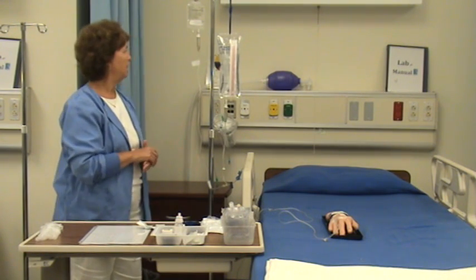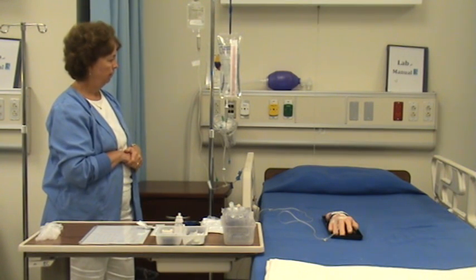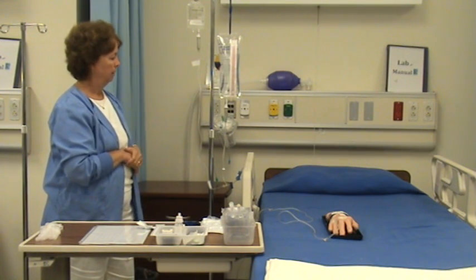So after the 30 minutes is up, you come in and you see that this one is dripping. This one's completed.